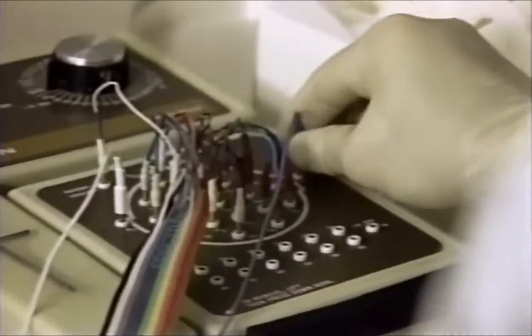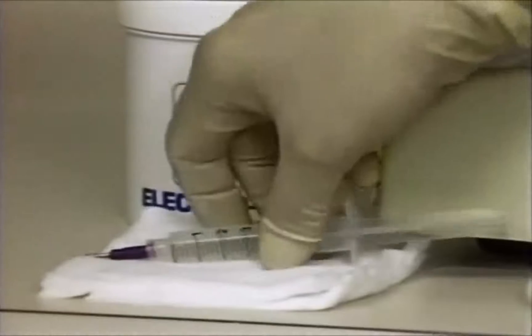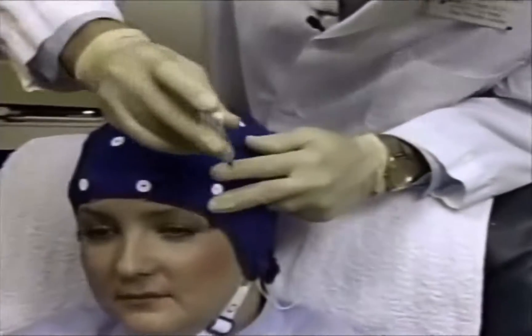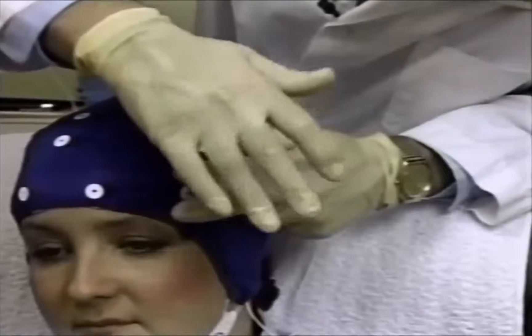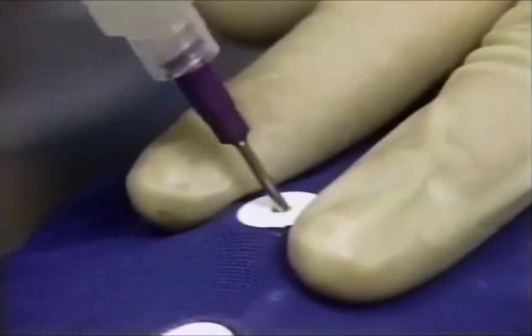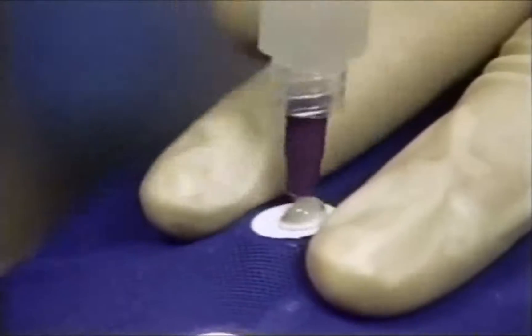To prepare the electrode sites, fill the syringe plunger with three to five cc's of electrogel — the normal amount needed to fill the electrodes in the cap. To fill, press the white mount against the scalp with the first and middle finger, insert the blunt needle into the hole, then lift the needle slightly off the scalp and inject the electrogel into the mount until a small amount of gel comes out of the hole.